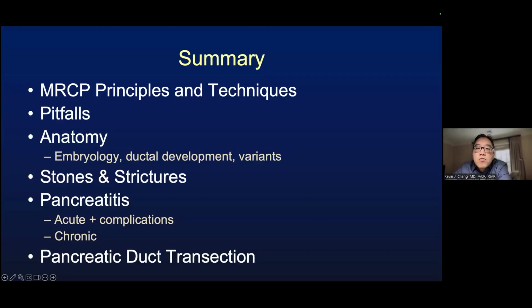Let's see. Next questions. Somebody asked about pancreatic calcifications. Could this be the only feature of chronic pancreatitis? I think it can be. Don't always see dilated ducts in these cases, but typically pancreatic calcifications, especially when they're in multiple locations in the pancreas, are associated with chronic pancreatitis.